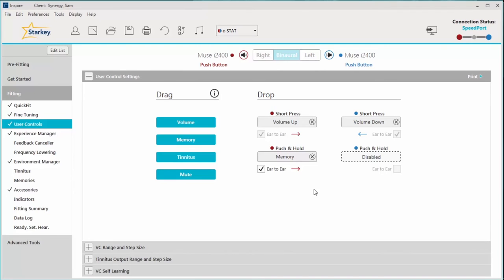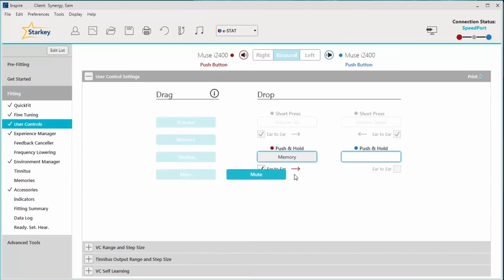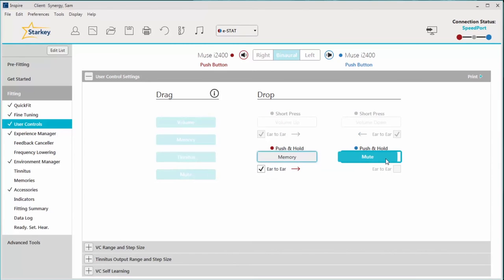In the event that your patient wanted a mute option, simply click and drag mute into a highlighted gesture. As you can see, you have the ability to configure the user controls to be as easy or as complex as your patient can handle.